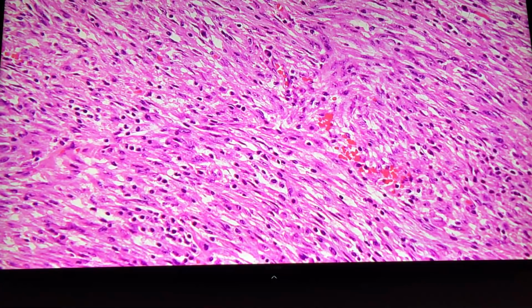All right. What could be your differential in a thing like this? Leiomyomas, mesothelioma? Yes. Do leiomyomas occur in the lung? Primary leiomyomas? No. Yes. If it's a leiomyoma in the lung, you have to be thinking it's a met from the uterus, so-called benign metastasizing leiomyoma. So let's just take that out. Say this is a solitary nodule. So it can be myofibroblast tumor. What's that? Inflammatory. Yes, very good.